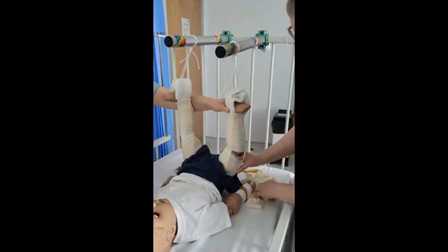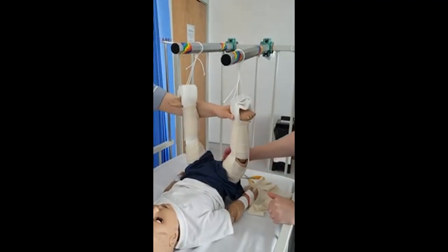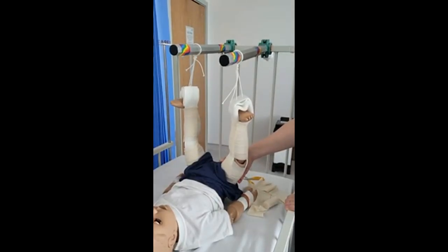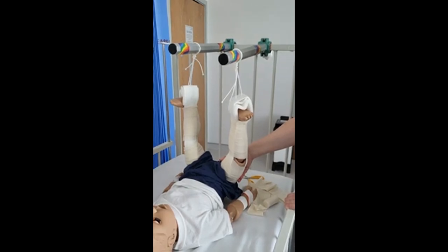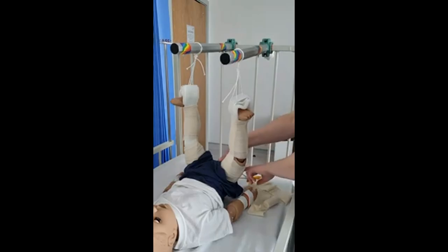It's important to get parents to keep an eye on the bandages, and if they're worried that they're becoming loose, to come and tell you so that you can come and do some cares. Some children, once they're starting to get better, wiggle around a lot, so we might find we're doing bandage changes several times a day.